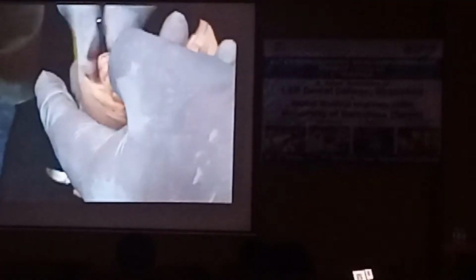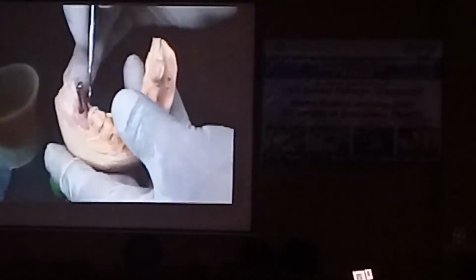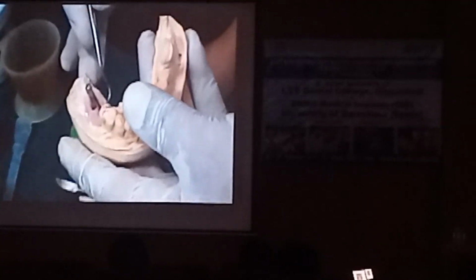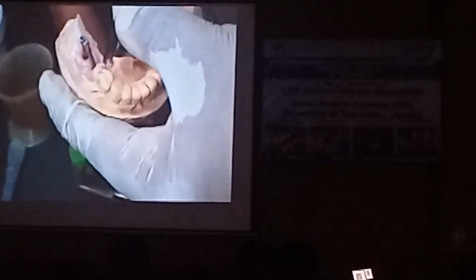Yes. So what happens is, when you pour a cast in case of an implant supported prosthesis, as I told you, you are making an impression of the soft tissue and the hard tissue. So this pink part represents the soft tissue. I can remove it also. There is a special material from Shofu, known as a GI mask or a gingival mask, which represents your gingiva.